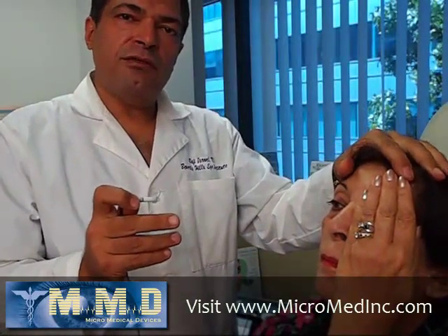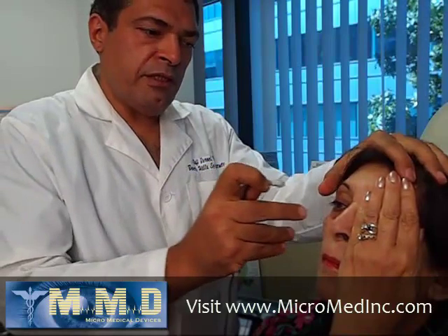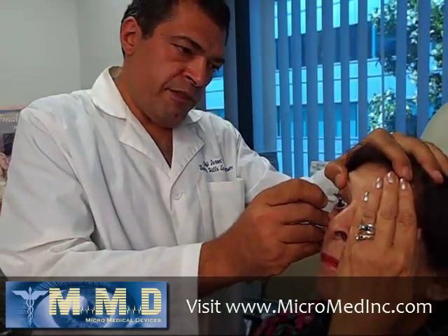This is how fast you can do immersion biometry using the Easy Immersion Tip.